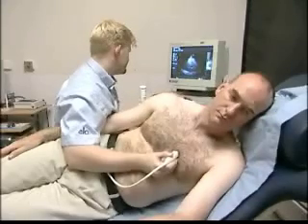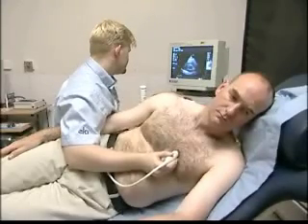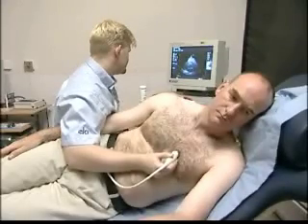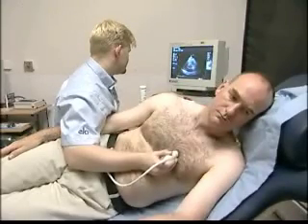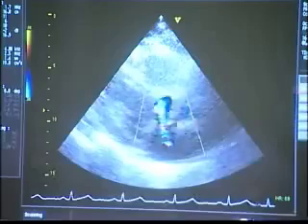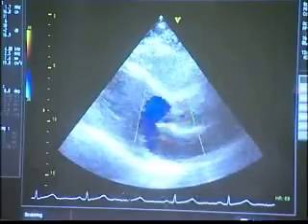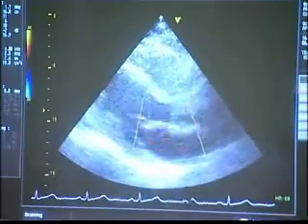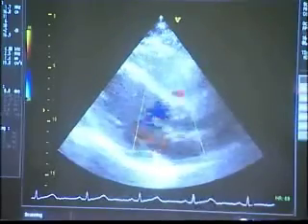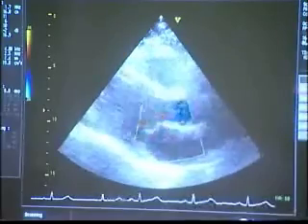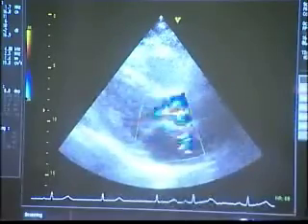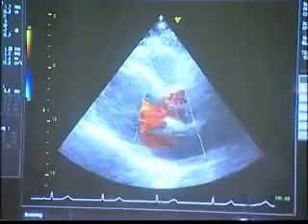Ultrasound reflected by blood flowing away from the transducer returns with a slightly lower frequency and shows up blue on the images. Conversely, blood flowing towards the transducer is shown in red.